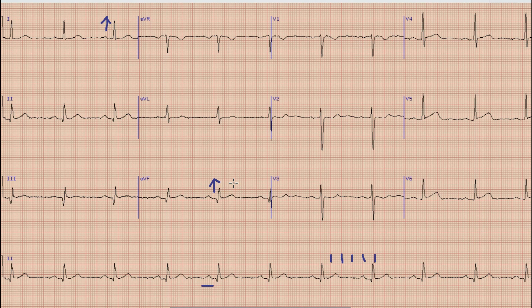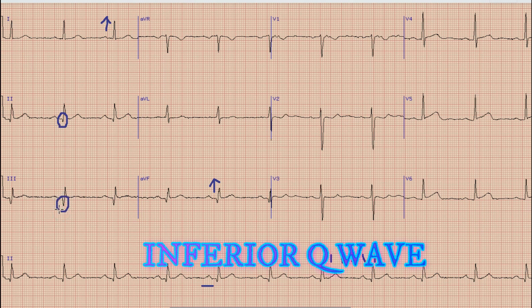After the axis, if we look at the limb leads — the inferior limb leads, that is lead 2, lead 3, and lead aVF — you can note that there are Q waves in these leads. Q waves are present in lead 2, 3, and aVF.